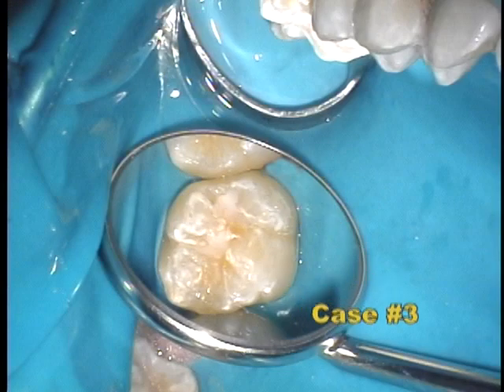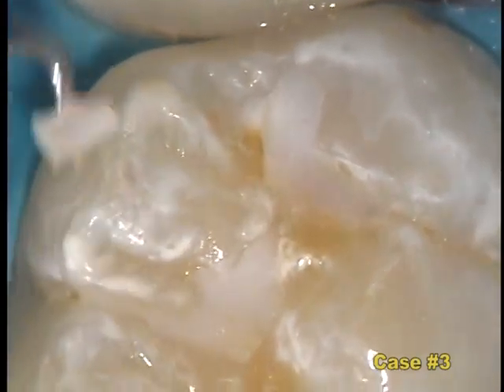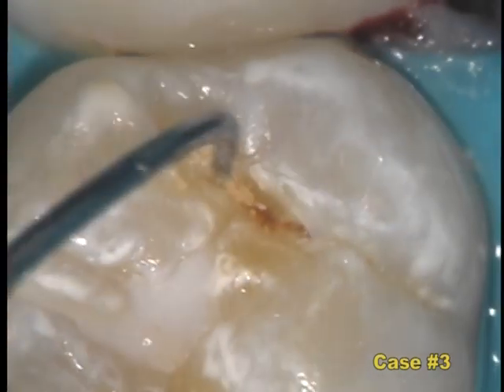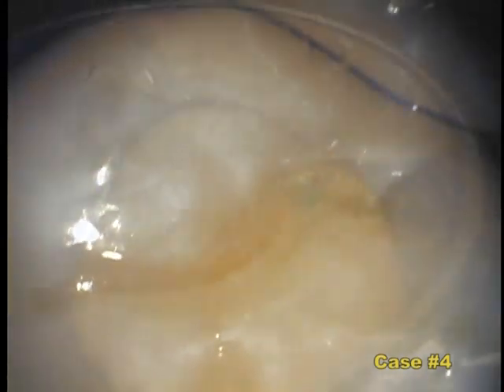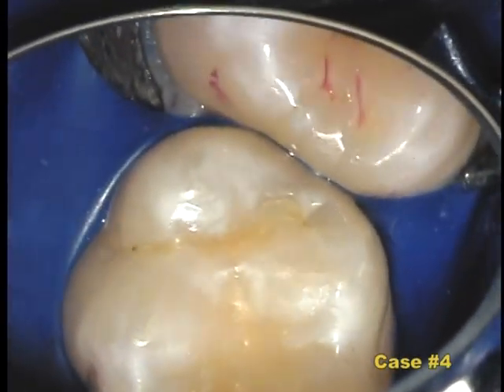In cases three and four, the sealant looks excellent to the naked eye. As we evaluate it with the microscope, we find active decay underneath. In this case and in many other cases, we see that the sealant does more harm than good because it hides the decay and gives a false sense of security that the tooth is healthy and safe.